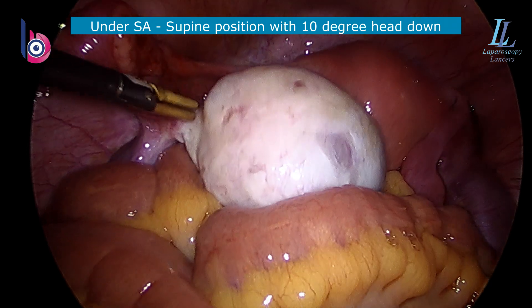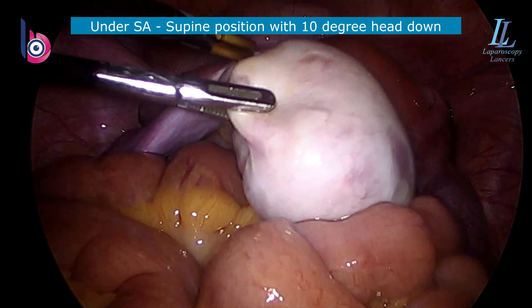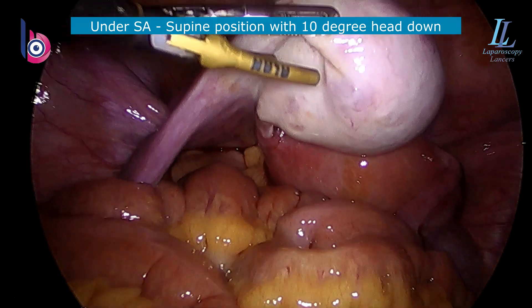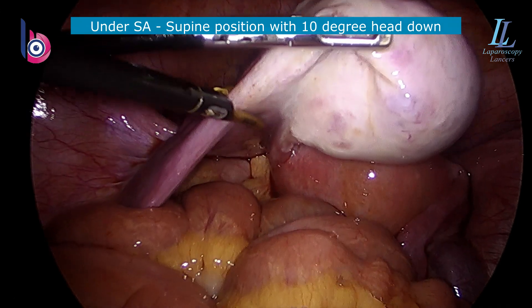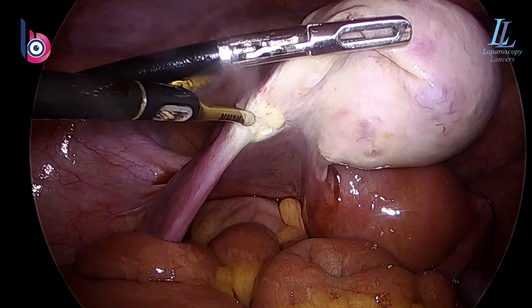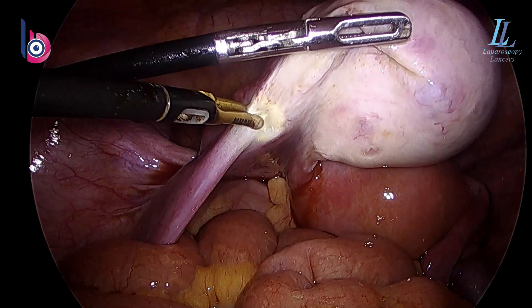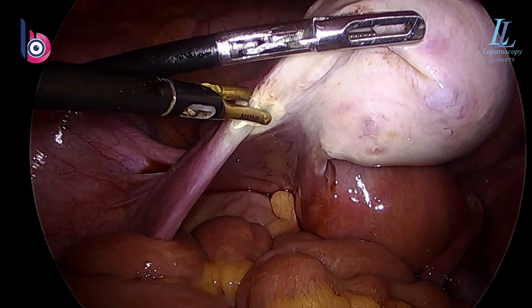The other ovary is almost normal, so we'll use that as the dissection plane. We'll be using a simple bipolar grasper and shear at 25 watts of the generator setting, alternating coagulating and cutting modes with my pedal.